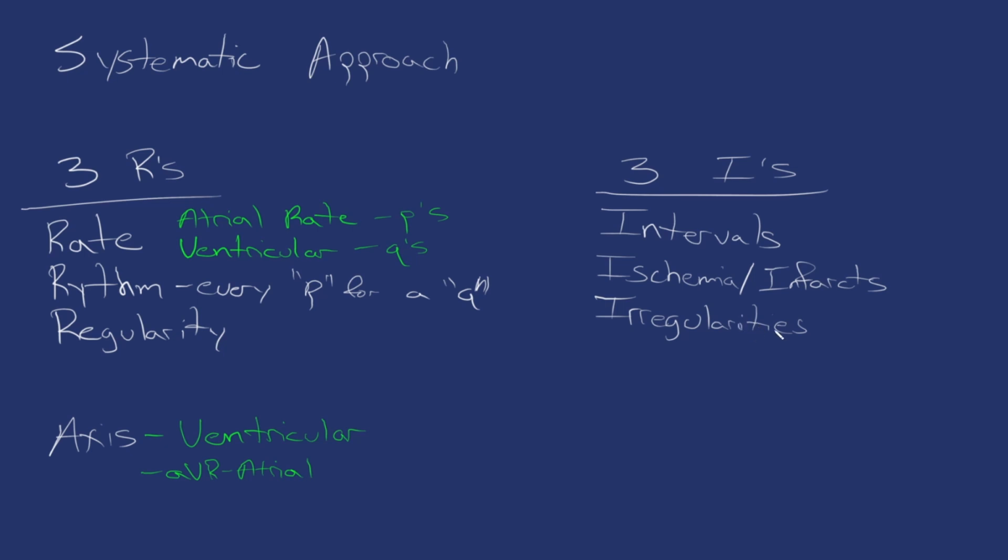An important thing in anything in your practice is knowing what is normal to know what is abnormal. We're not always going to know exactly what's going on in the EKG unless you're an EP cardiologist or something. Even sometimes they might see something that's out of whack that they don't even know what's going on. It's important to know just that something isn't right. So if you go through all these and something still isn't adding up, that's the point. You can ask more questions, bring it to somebody else.